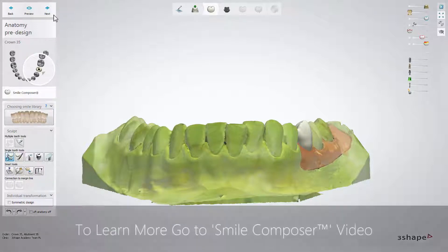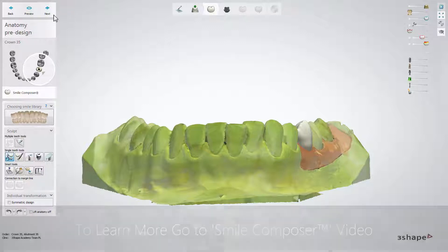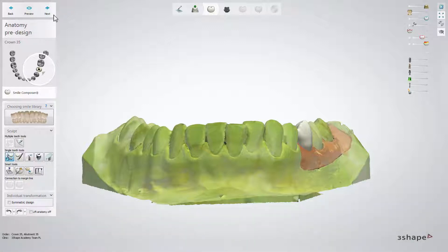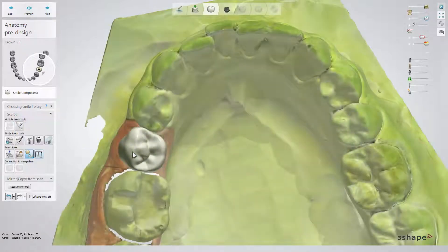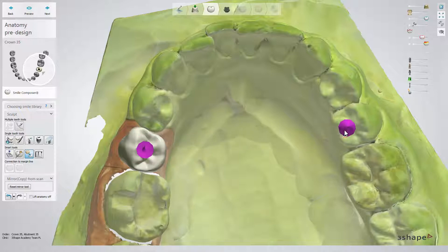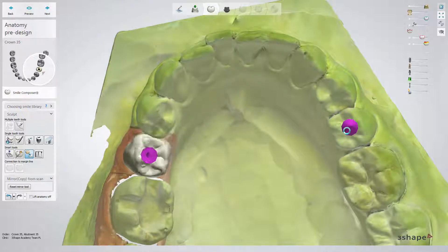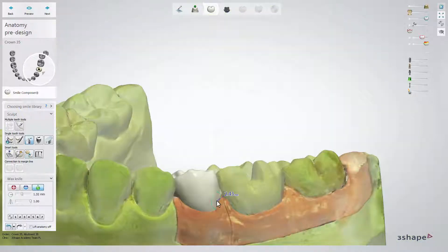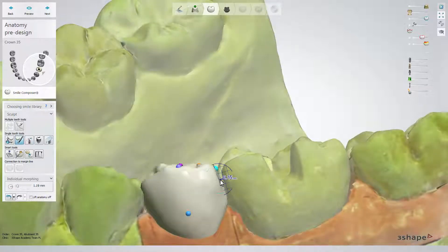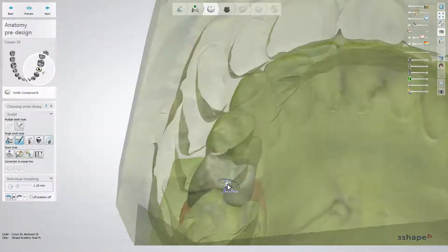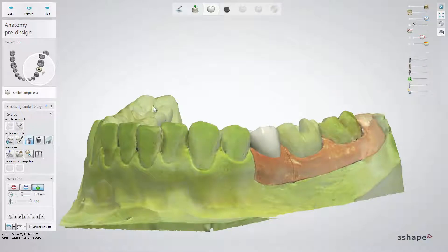Now, when you are in the anatomy pre-design step, use the Smile Composer tools to position the future tooth and designate the right space for abutment design. In cases where you have a full arch scan, use the Mirror tool to copy from the other quadrant. The final shape of the future crown will be designed in further stages. Click Next when you are ready.